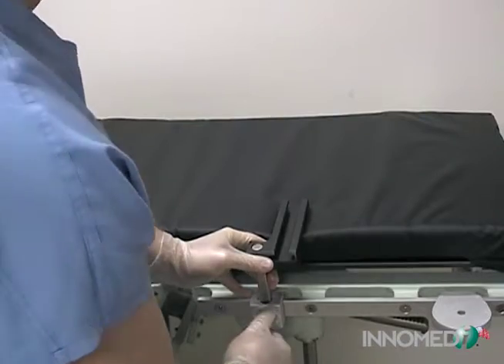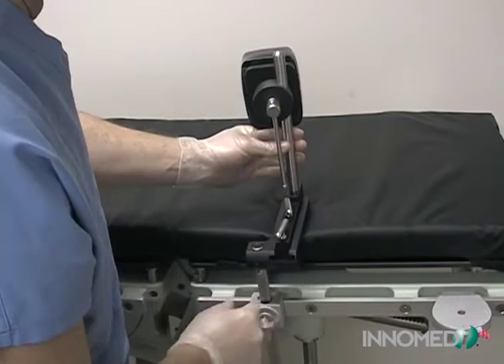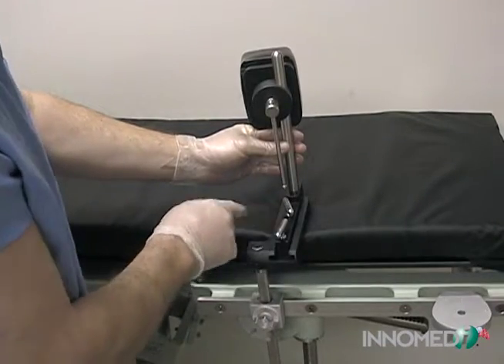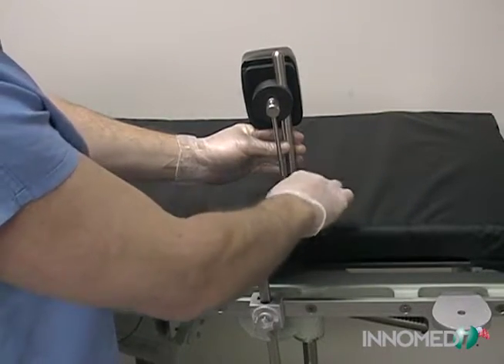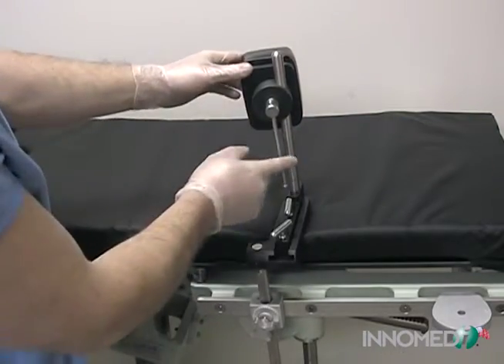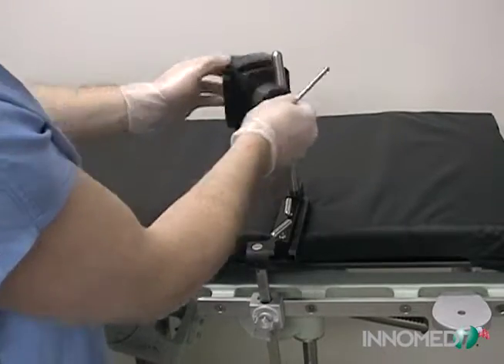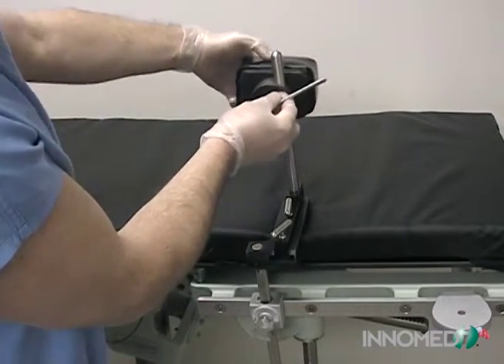The track is inserted into the table clamp and secured. The base slider has two T-handle locks and is inserted into the table attachment's track and secured. The bar on the pad block allows the pad to move up or down the upright and be adjusted to the desired position. The bar is then tightened to secure the position.